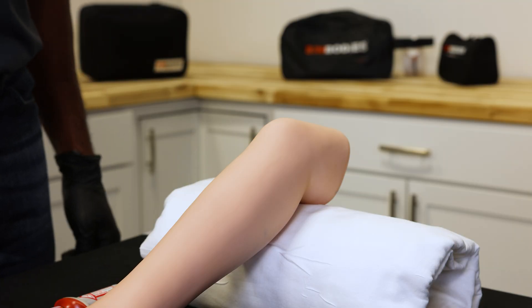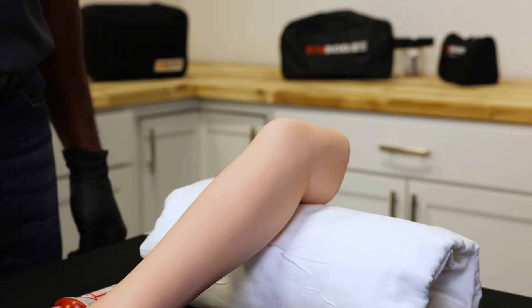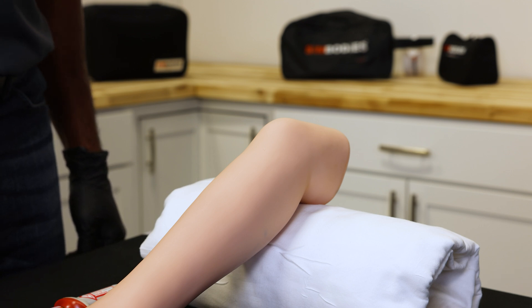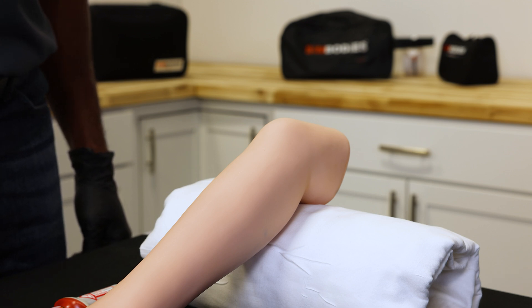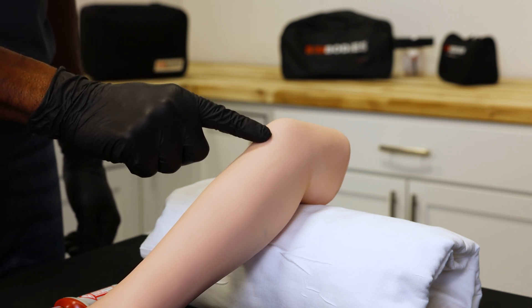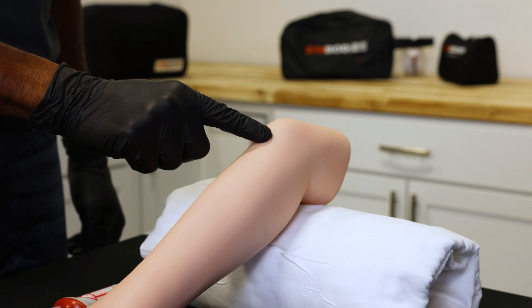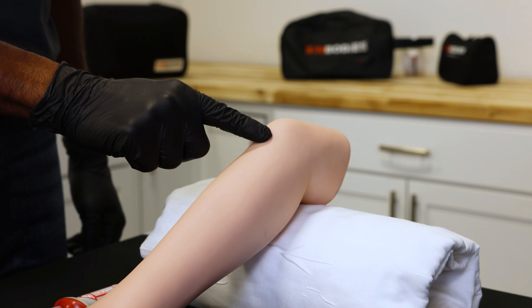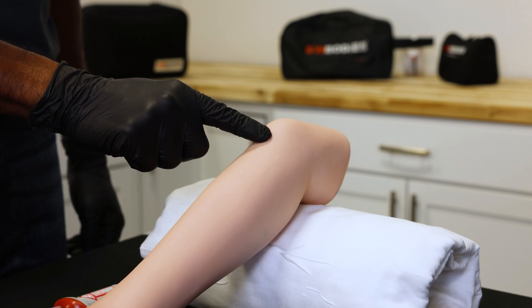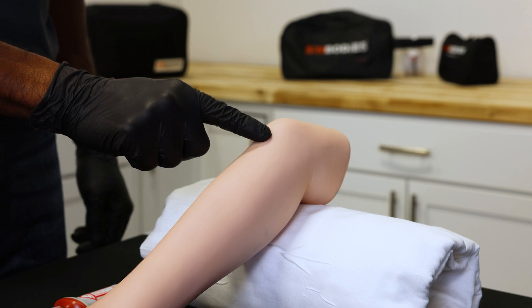Let's start by identifying the intraosseous access site on the tibial tuberosity for a pediatric patient. The tibial tuberosity is located on the anterior aspect of the shin as shown here. The Big P can be used on patients ages 0 through 12, and there are two ways to locate the insertion site on the tibia.